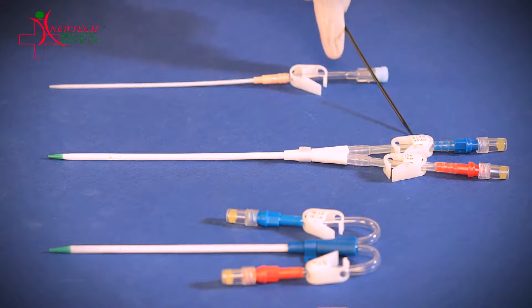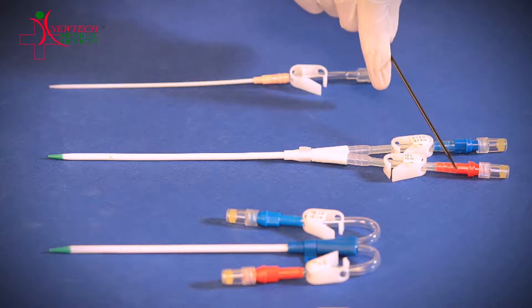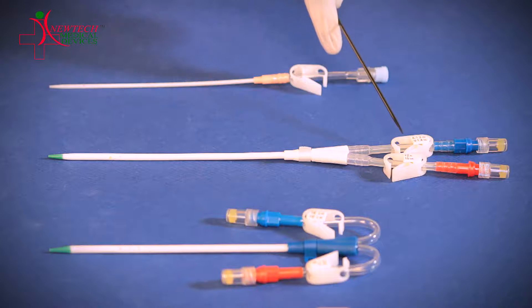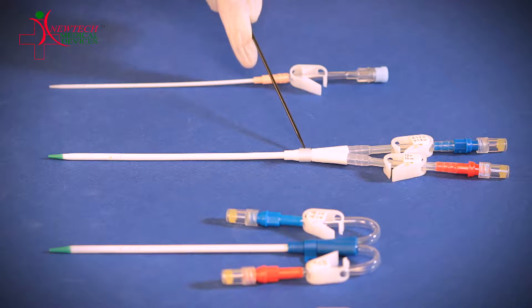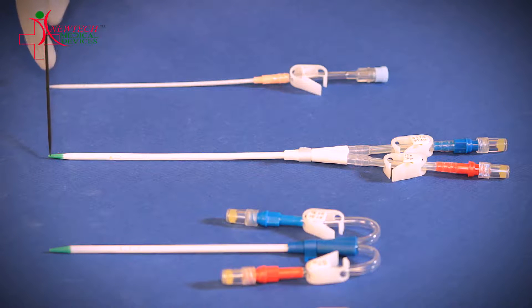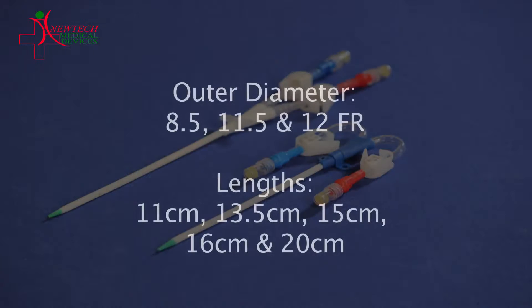This is a double lumen catheter. There are two lumens: the distal end and the proximal end. Sizes available are marked on the clamps. This is the hub. These are the rotatable suture wings. This is the total length of the catheter which gets inserted into the body. This is the tip of the catheter. These are the side holes connected to the proximal end. The double lumen catheter is available in various diameters and lengths.